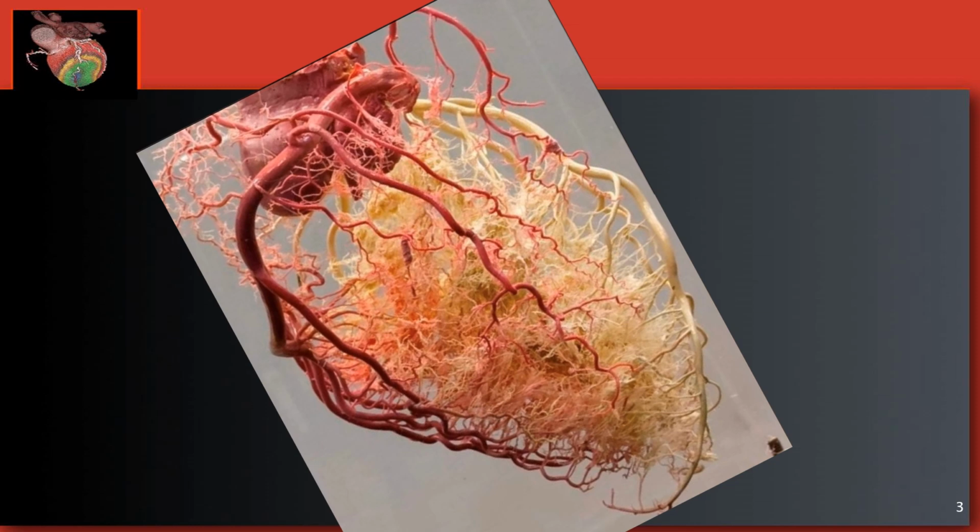And the problem with traditional cardiovascular imaging, whether you're looking at a heart cath or typical SPECT and PET imaging, is that you don't see the microvasculature. A lot of people could have coronary artery disease, and it will show up in the small, tiny vessels, especially with calcium buildup, before it shows up in the larger epicardial vessels and actually creates an occlusion.